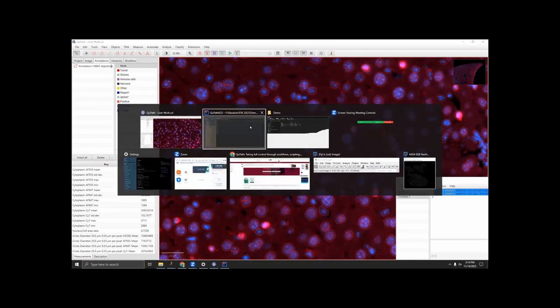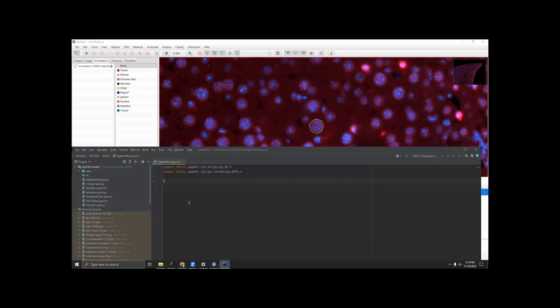So back to IntelliJ. We know we want to be working with cells, so the first thing I'm going to do is just grab my cell objects. And to do that, I just go def cells equals getCellObjects. And you can see in IntelliJ, as you start to type, it auto-suggests. This def is a way of initializing variables in Groovy, where you don't need to specify exactly what type of variable it is. It will try to figure it out from context. And if you hover over this function, usually it works, but of course it's not right now.